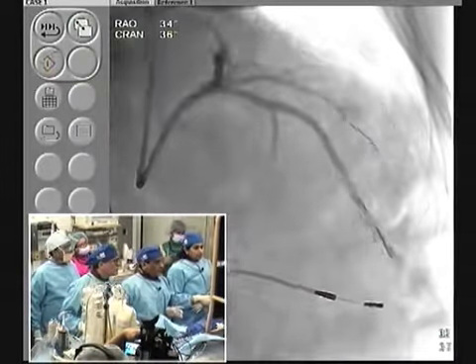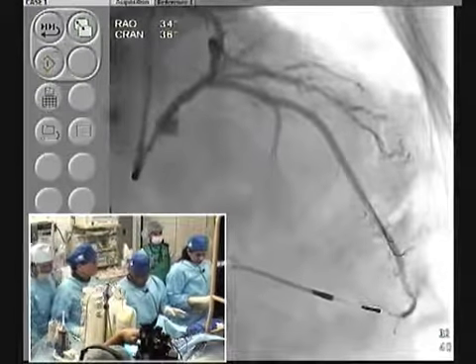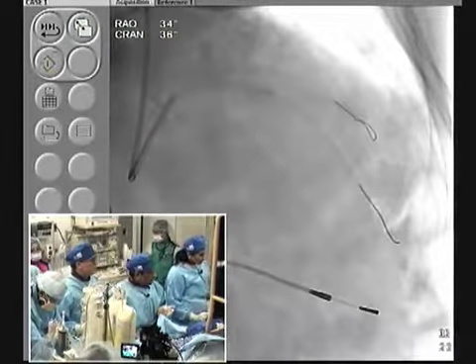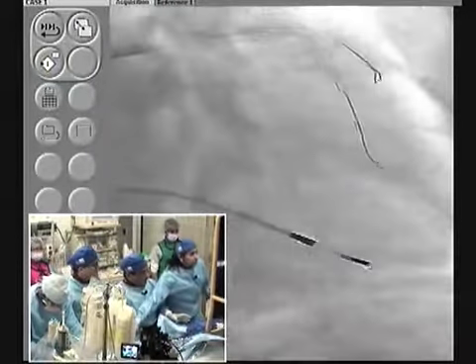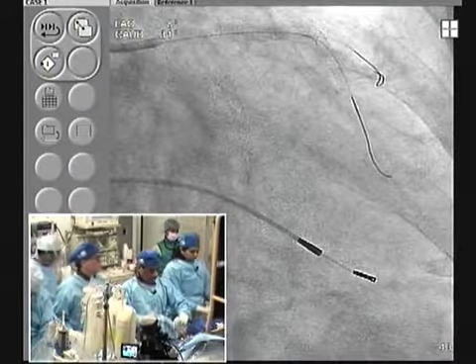Now you can see here. Now, are we ready for another shot of the OCT? You will need a new catheter. Every time you try to come out, since it is a short monorail, it is probably destroyed. Leave it. I take out the wire.